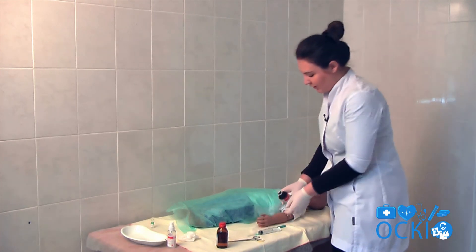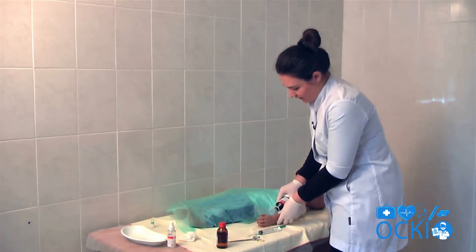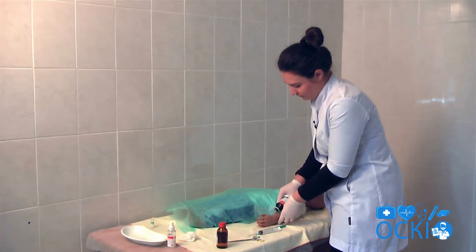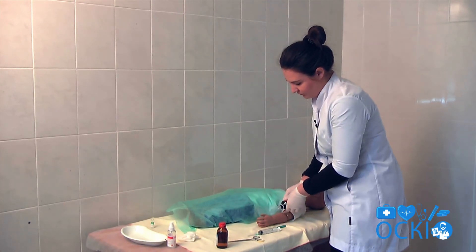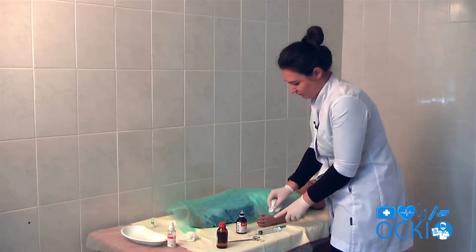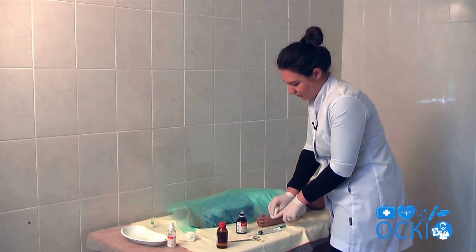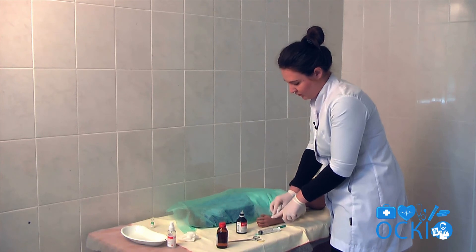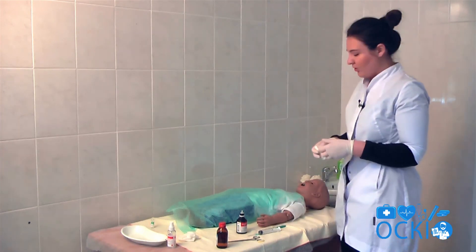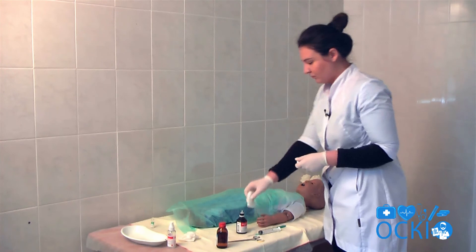Treat the cavity with antiseptic, dry it, and drain with rubber gloves.